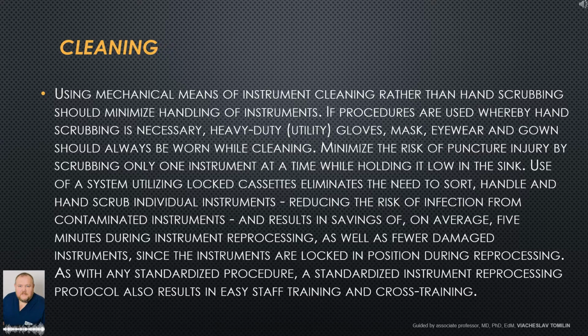in the sink. Use of a system utilizing locked cassettes eliminates the need to sort, handle and hand scrub individual instruments, reducing the risk of infection from contaminated instruments, and results in savings of, on average, 5 minutes during instrument reprocessing, as well as fewer damaged instruments, since the instruments are locked in position during reprocessing. As with any standardized procedure, a standardized instrument reprocessing protocol also results in easy staff training and cross-training.